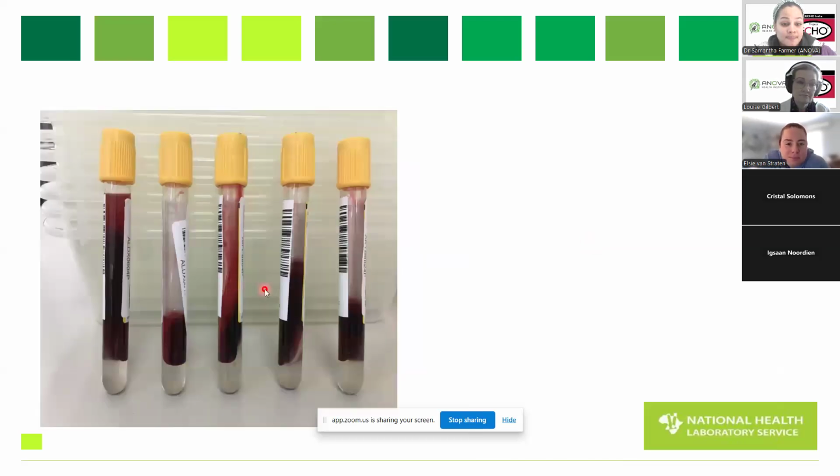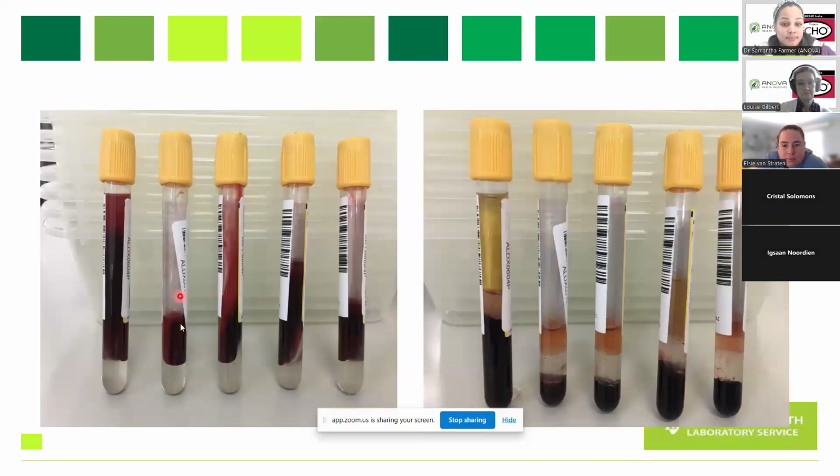This is not a great picture, but this is the kind of thing that you're sending. These are the 5 tubes that recently were sent to a lab, and after I'd taken this picture, we centrifuged them. So in this second tube, what you thought was a lot of blood actually only produced that amount of serum. What looked like a lot of blood, that's just scraping on the side, very little amount of serum. So this guy did the right thing, filled the tube to the full line, and you've got a good sample. And also you can see this guy struggled a bit to get this very little amount of blood. And there's a bit of hemolysis in there as well, which could affect some of the tests.